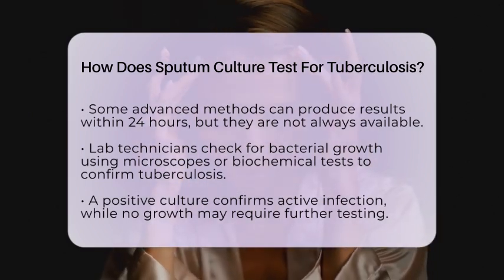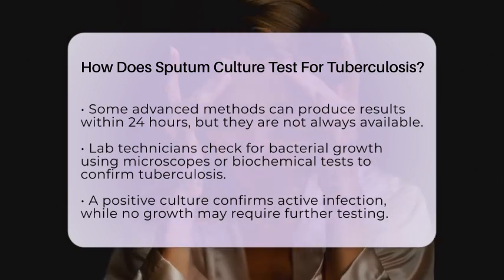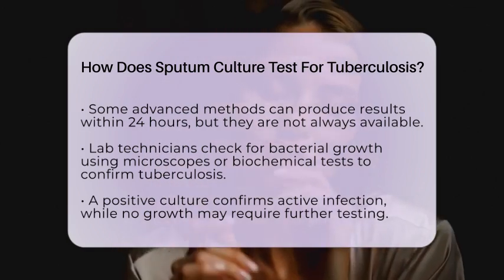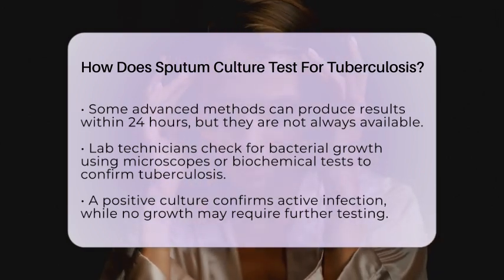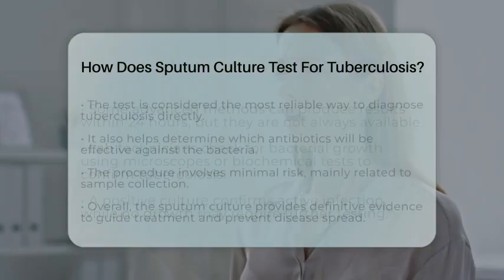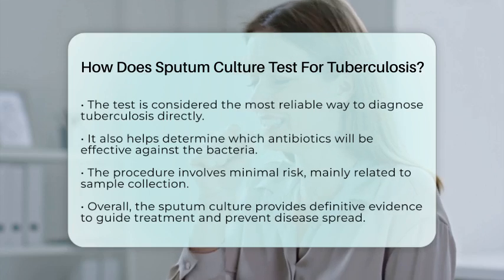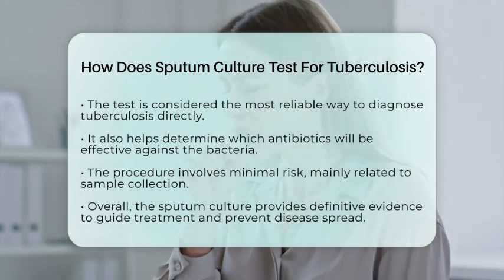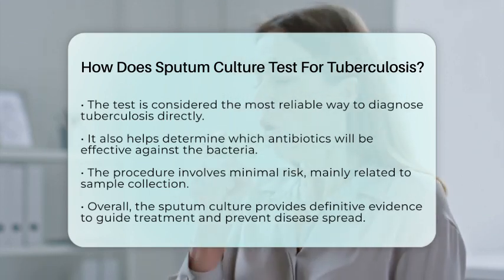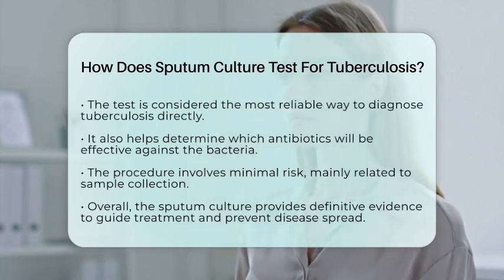If no bacteria grow after the incubation period, it suggests that the sample did not contain detectable bacteria at that time, but further testing might be needed if symptoms persist. This test is considered the gold standard for diagnosing tuberculosis because it directly detects the bacteria responsible for the disease. It also helps doctors determine which antibiotics will be most effective by testing the bacteria's susceptibility to different drugs.